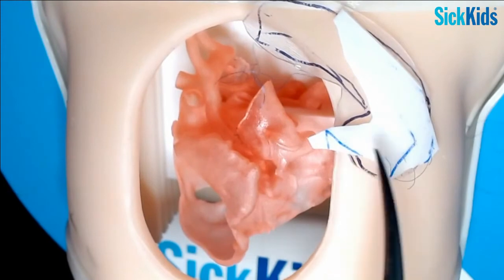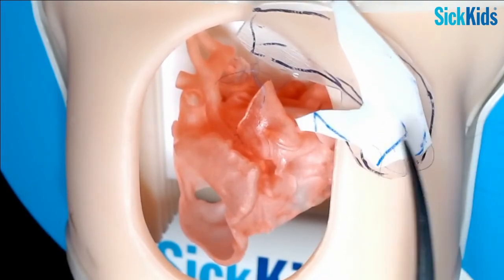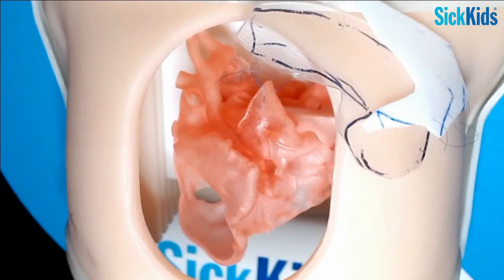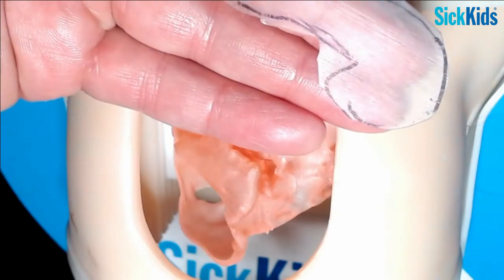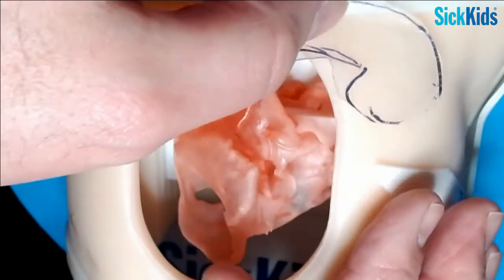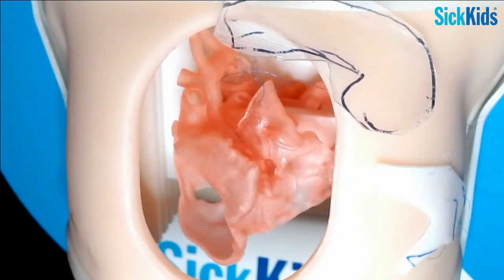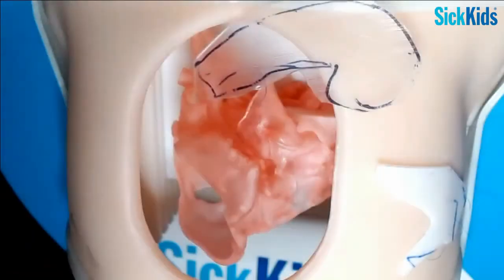So this was more pointy, but you've got that long tail. So this is the underside. The outer side is much longer. All right? Great. But you can have successful artery constructions with the patch looking a little different than that. Some of them will look more like this. And some of them, depending upon the particular anatomy, may not have as much of a bulge right there. But they all kind of have a long tail on them.